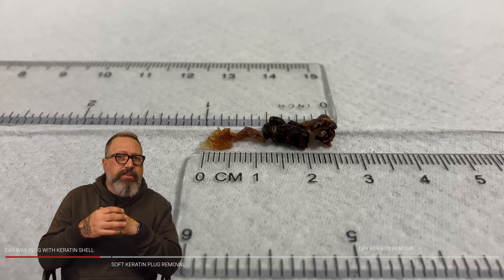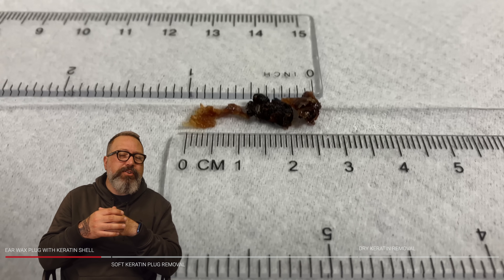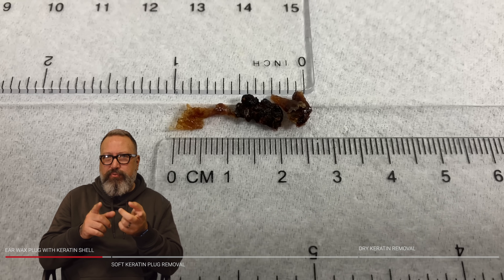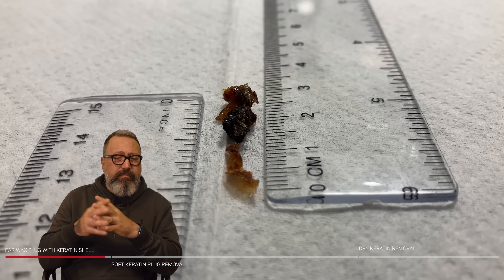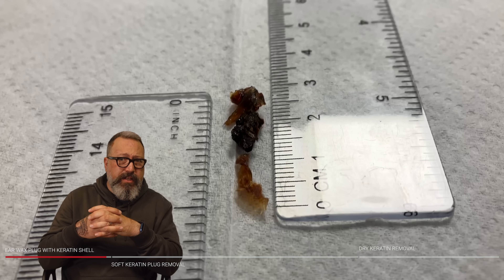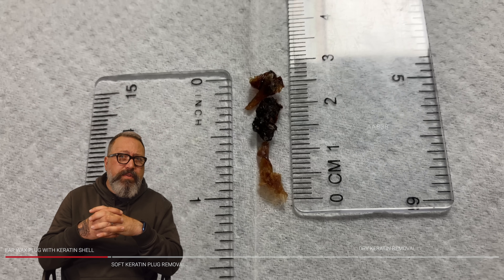So just one ear canal on that one — two and a half centimetres, bang on one each. This is pre-new rulers, guys — this would have been probably earlier in the year. But that's come away really, really nicely. No issues there.